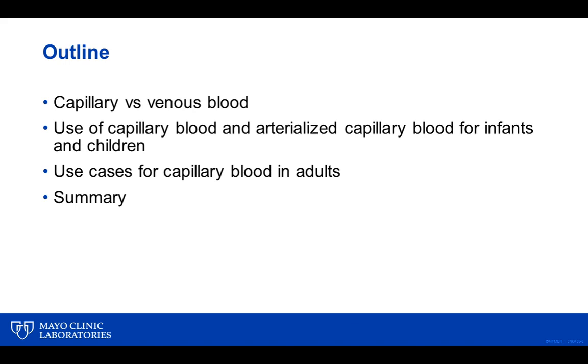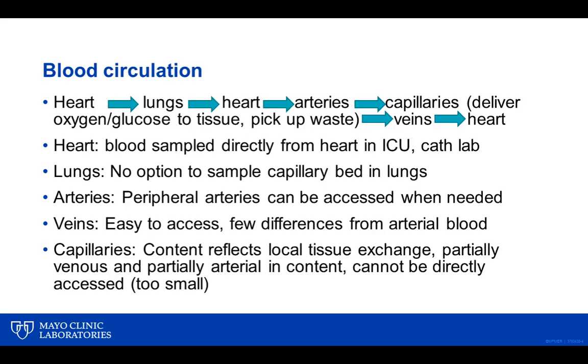We'll talk about the use cases for capillary blood in adults. They do differ somewhat in terms of where there's an advantage to capillary blood use in adults. And then, again, we'll summarize and have time for questions from the group, and there are a few submitted before the presentation today.